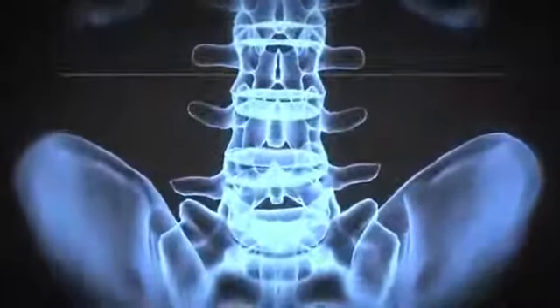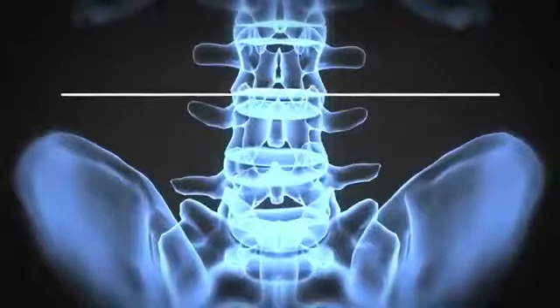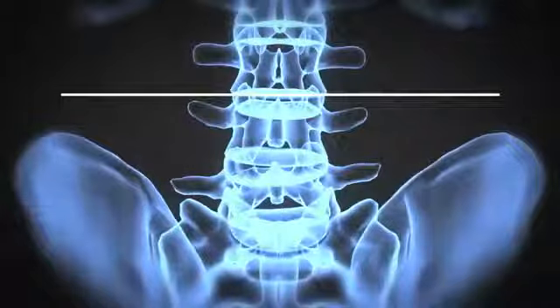To begin, use AP fluoroscopy to center the guide wire across the cephalid most pedicles of the motion segment to be instrumented.